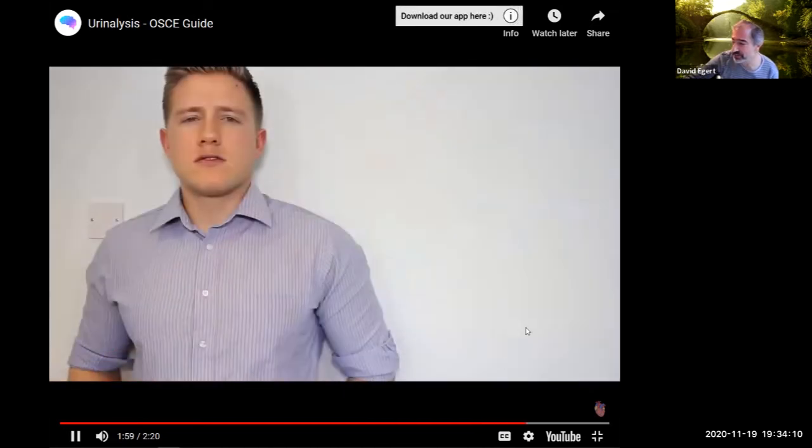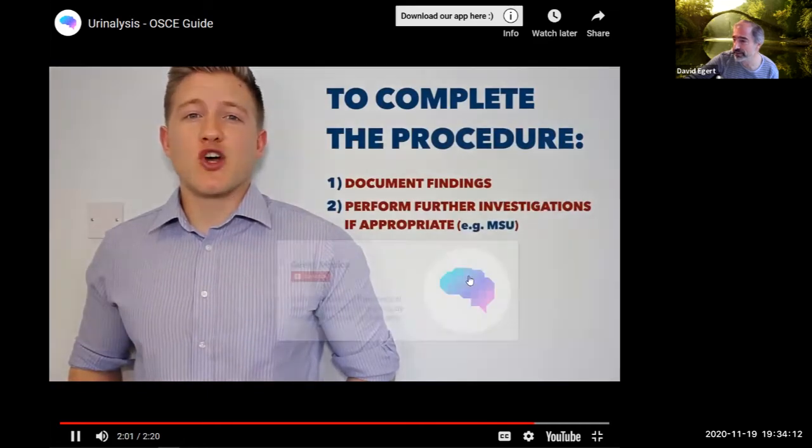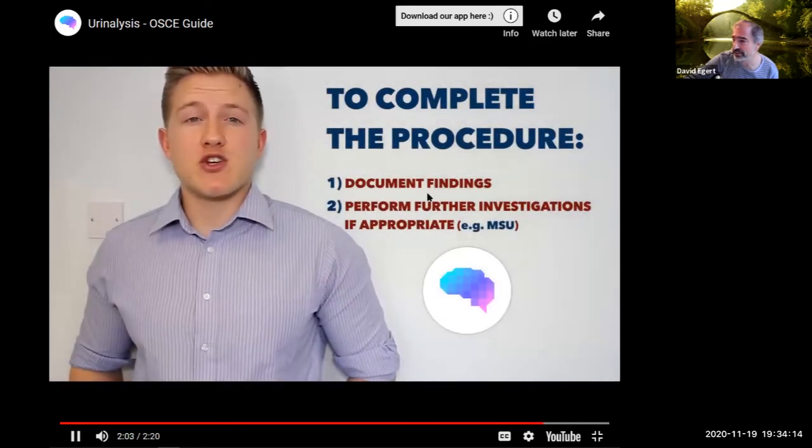This guy is... To complete the procedure, I would document the results of the urinalysis in the patient notes.